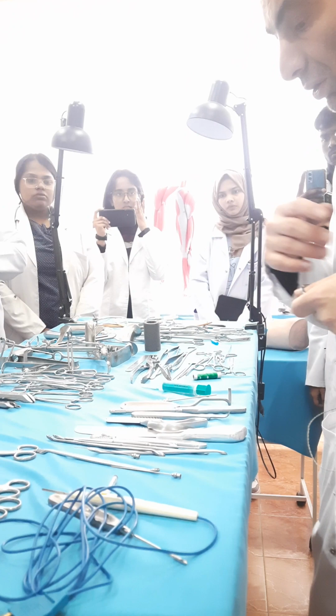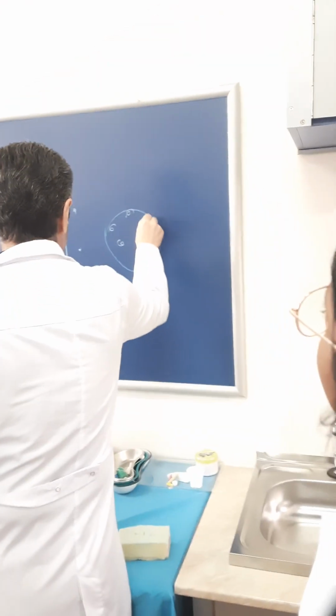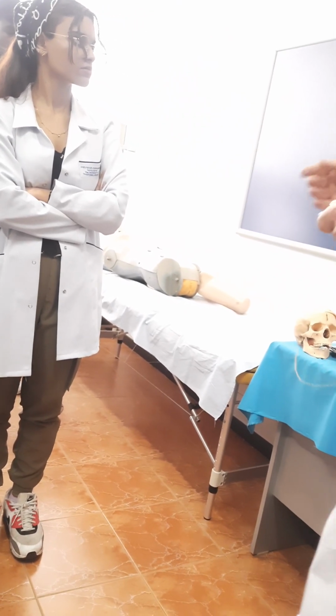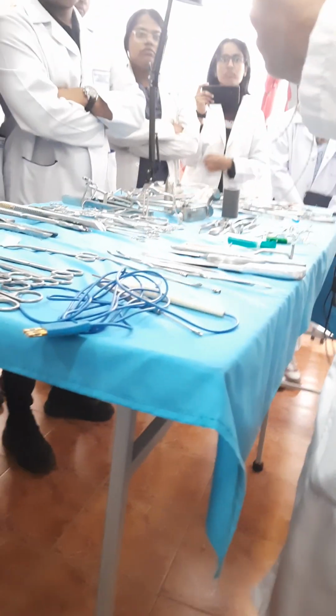After this, now look at the blackboard. Please, for example, these are your drilling apertures. Usually, by the way, if it is osteoplastic trepanation, it means you must open the box and then replace the cap in its place. You make 5 apertures. After making these apertures, you take another instrument, which is called the raspatory.